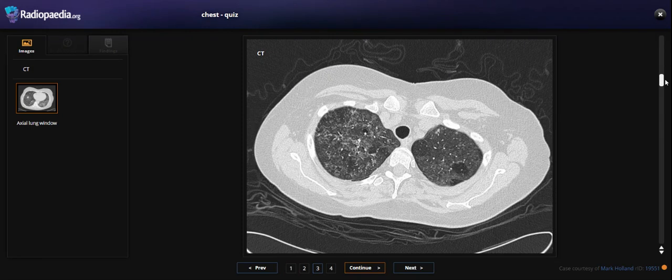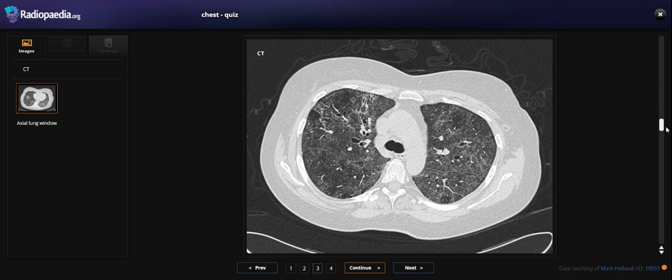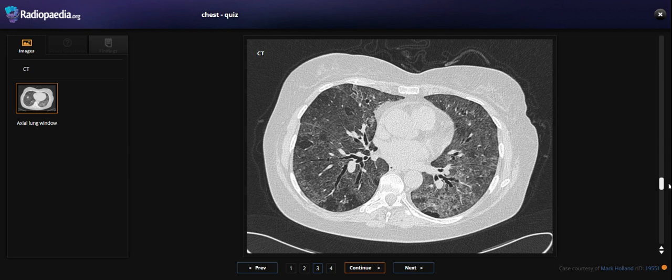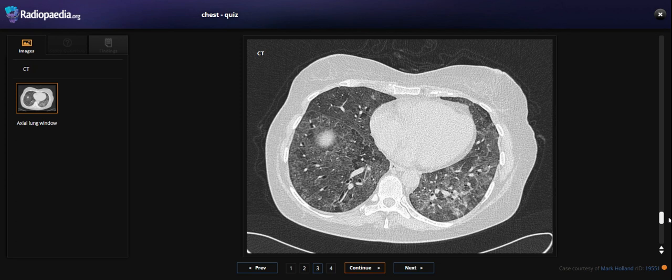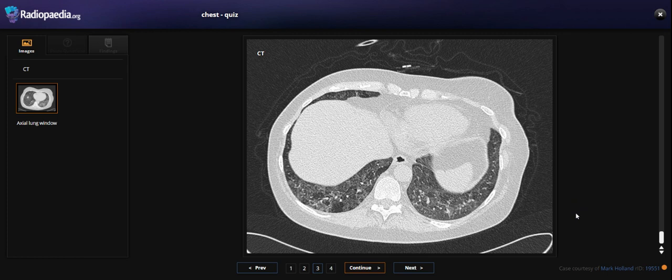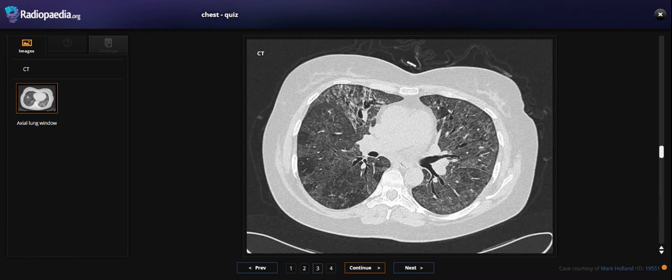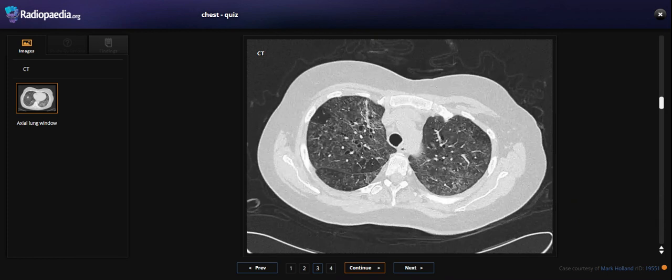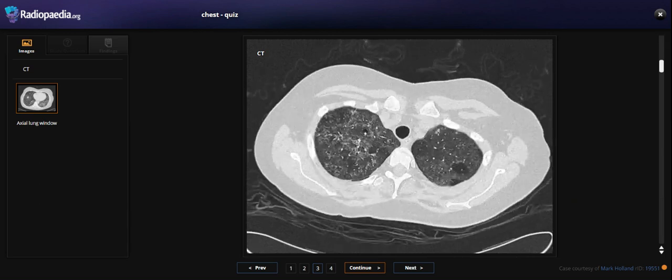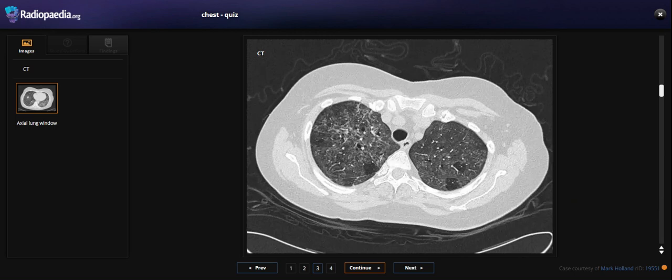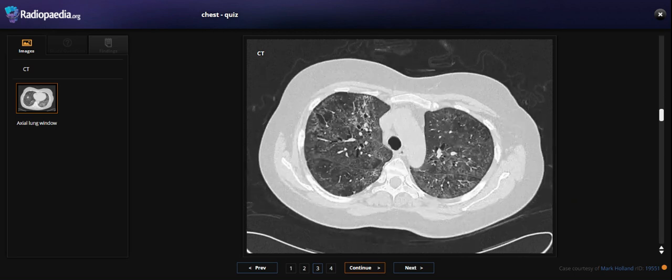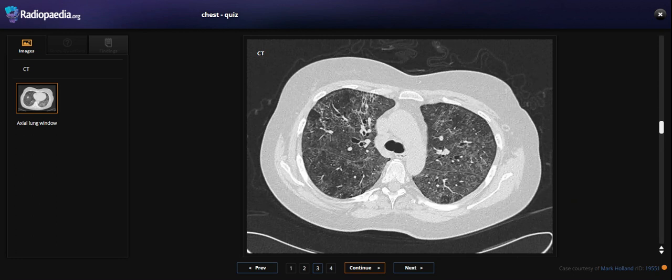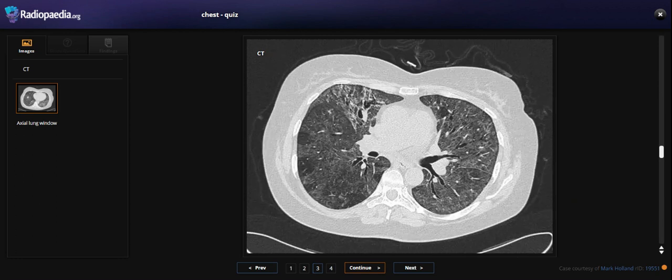What we see here is bilateral ground glass opacity with some reticular pattern, mostly in the peripheral portion.